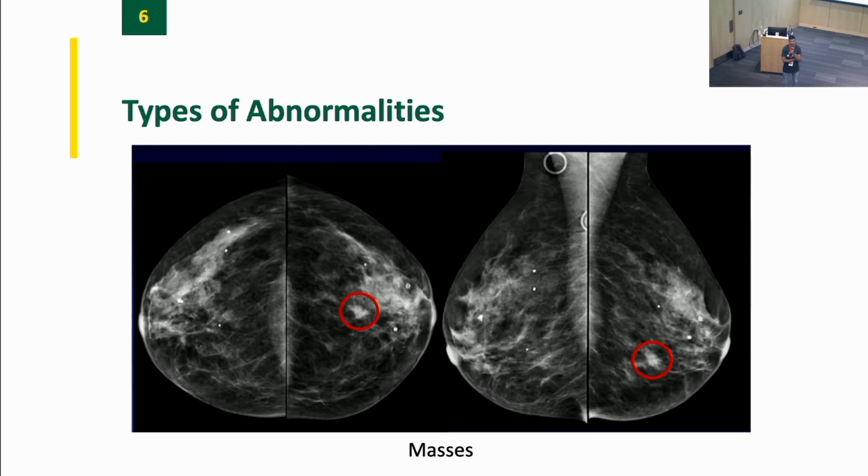of work that I've seen around testing models trained on 2013 to 2018 data, training on 10-year-old data and testing it on 2-year-old data, or training on 10-year-old data and testing it prospectively. Does the more recent data perform better than older data? We don't have the luxury of being picky, right? If we had to mine 110,000 women to find 3,000 cancers, right? So if we start getting picky on the age of the scan, that will continue to dwindle. But it's a very good point. I would say largely it's unanswered unless somebody else in the room knows something different.